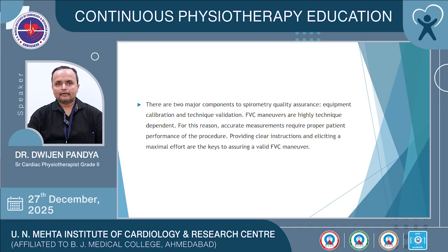To validate the technique, the maneuver must be properly explained to the patient. The patient must be made to sit comfortably and place the mouthpiece in his or her mouth. The maneuver should be explained to the subject by the therapist. It should be performed once or twice so that there is no doubt, and the proper readings should be taken.